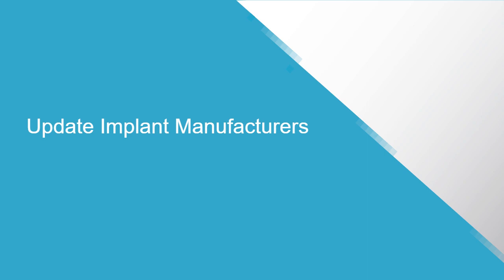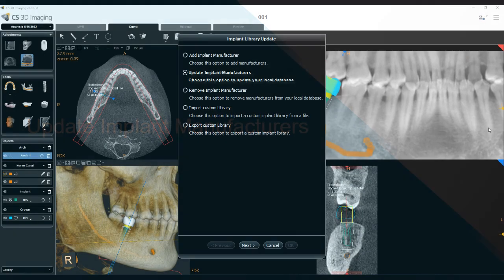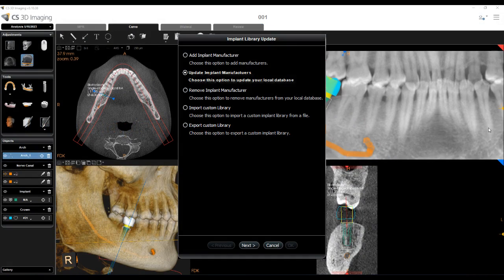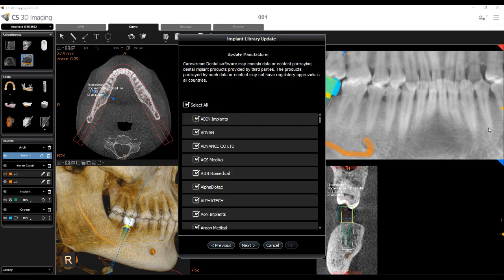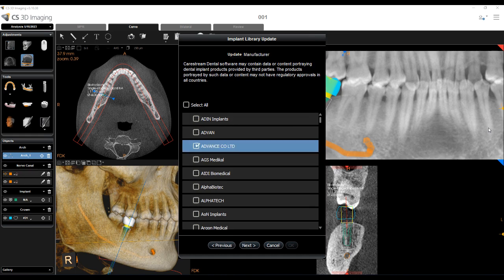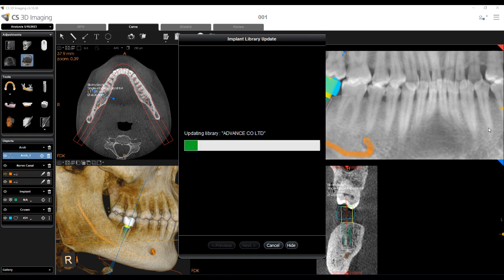Update Implant Manufacturers: Select Update Implant Manufacturers and click Next. A list of implant libraries available to update is displayed. Deselect the manufacturers you do not want to download and click Next. Click Hide if you want to perform the implant update in the background while you carry on working. When the update is complete, click OK to finish, or Previous to return to the options menu.